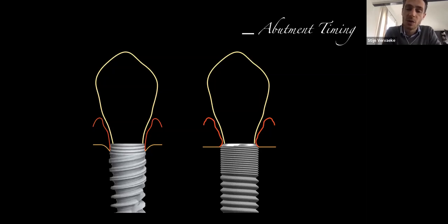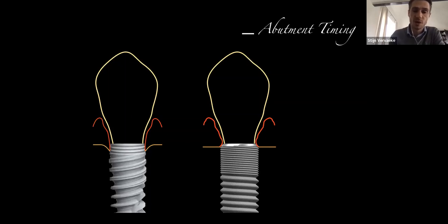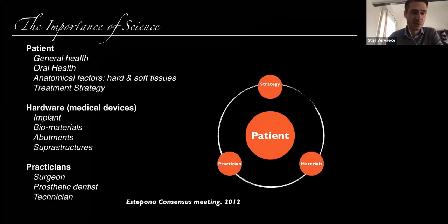But you don't see bone loss beyond a certain level when you do that. And of course we have the platform shift and we have the smooth implant collar on the AstraTech EV implant. So that means that basically when you remove the provisional, you don't lose the entire soft tissue attachment. So you still have attachment on that smooth collar. But of course, preferably you want more. This is only 0.5 millimeter, so it's not much, but still you're not losing the entire soft tissue connection, which makes it a very suitable implant for those indications.